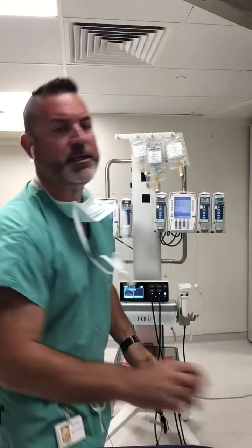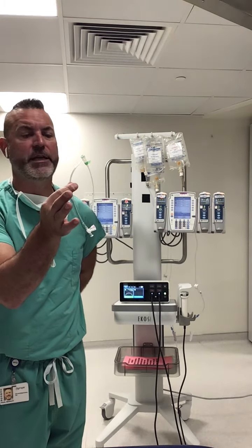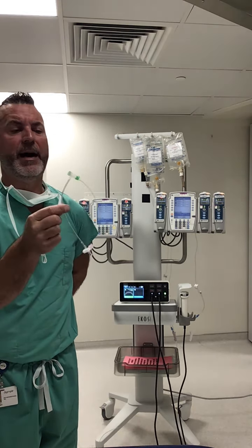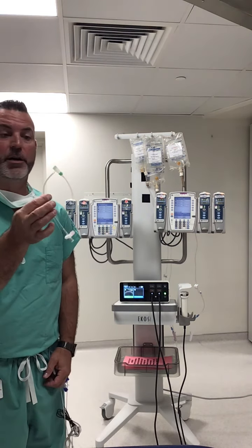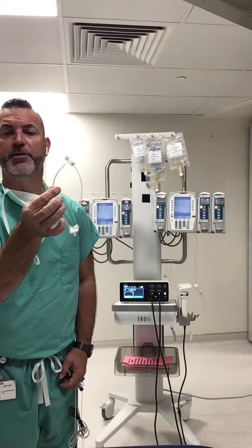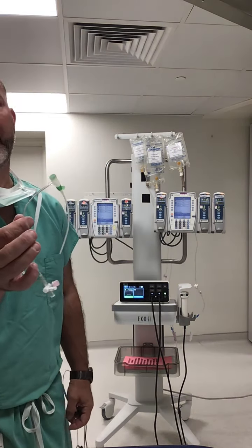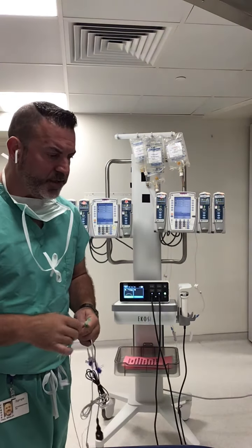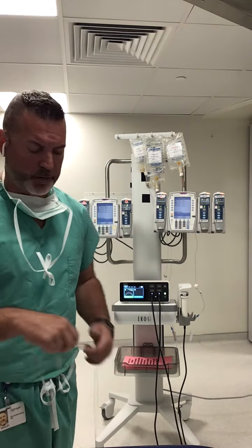Now, as promised, I taught you about our third piece of the apparatus, okay? This is our introducer sheath that I was telling you about earlier. This is not part of our EKOS device. Any lab, IR, cath lab, OR, wherever you're putting these devices in, are going to have what we call an introducer sheath. This is a 6-French introducer sheath. This is the minimum required size that we need, okay? It's green, so it's a 6-French sheath. So this is not part of our device, but you're going to see it on every EKOS catheter. So why am I talking about it?